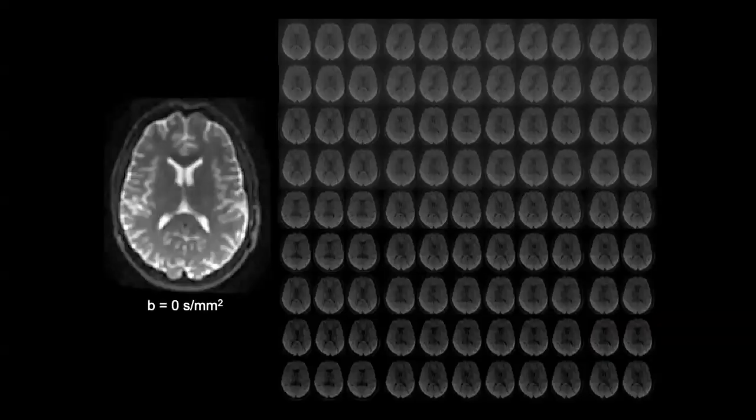But if you want to extract more information, then you're going to need to acquire more data. Nothing is free, right? So some of them, you have b-values up to 2,500, 5,000 to be able to calculate those non-parametric models in HARDI. You need a lot more directions if you want to resolve multiple tensors or the shells of the Q space. So you need a lot more data, which takes a lot more time.